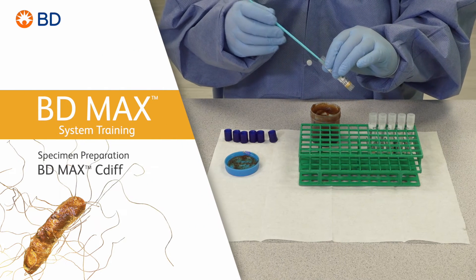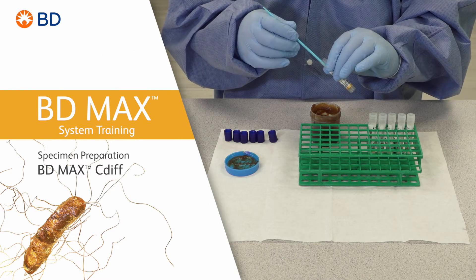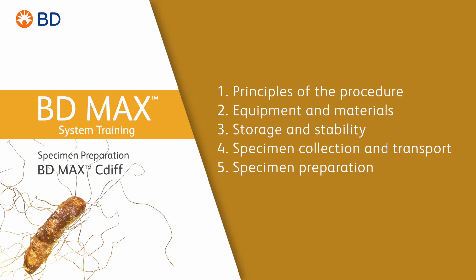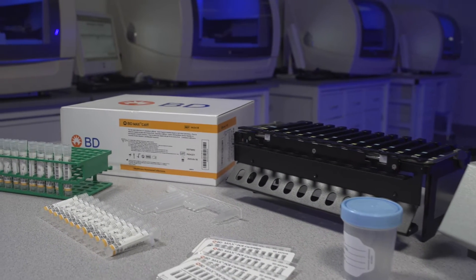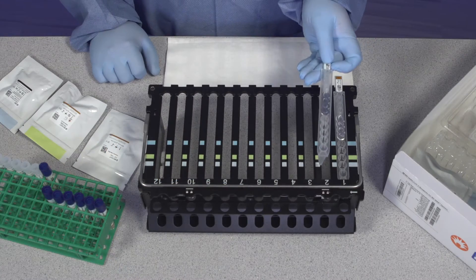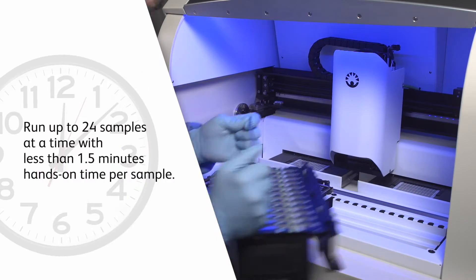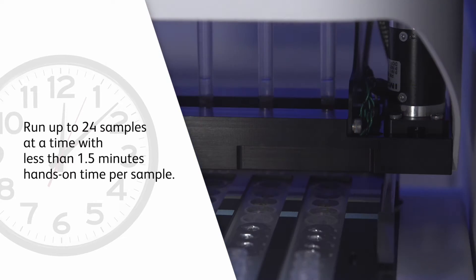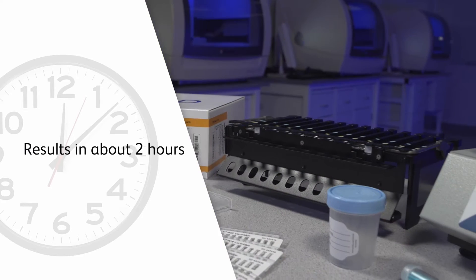Welcome to the training video on the basics of proper specimen preparation for the BD MAX C. diff assay performed on the BD MAX system. The BD MAX system offers you a simplified and automated workflow, allowing you to run up to 24 samples at a time with less than one and a half minutes hands-on time per sample. You can get 24 patient results in about 2 hours with the BD MAX C. diff assay.